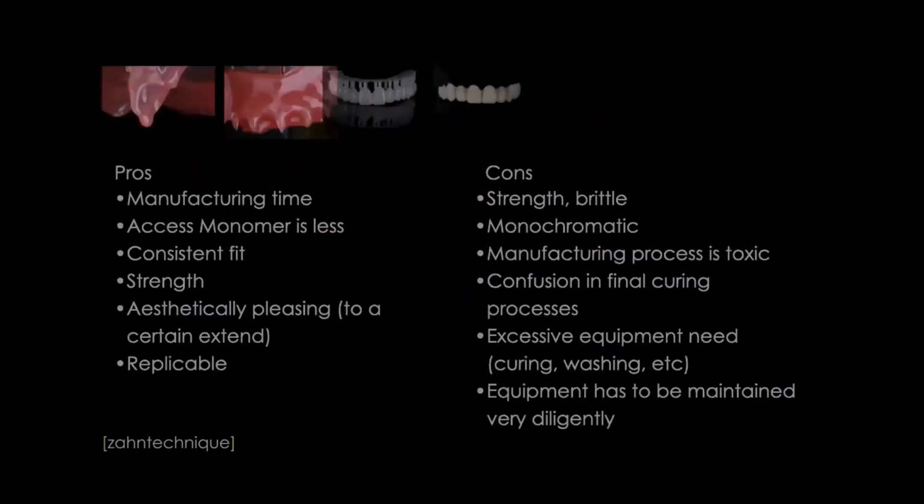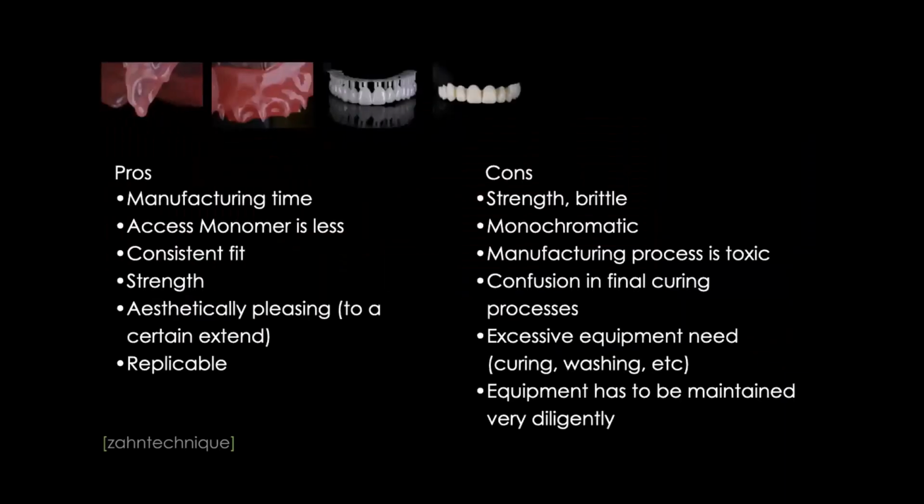If you look into the resins, there are pros and cons, right? So what are the pros maybe? The pros, definitely manufacturing time. It's way faster. There's less chemicals, so excess monomer is less. They're very consistent in the fit, which is also very important. They're very strong. They're very aesthetically pleasing to a certain extent, I would say, with printable, and they are very replicable. Great.